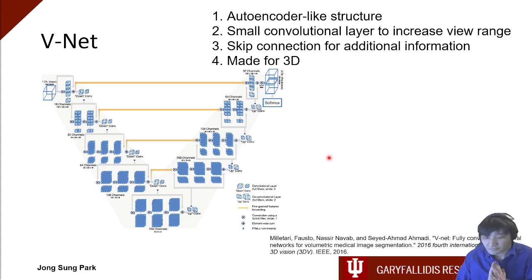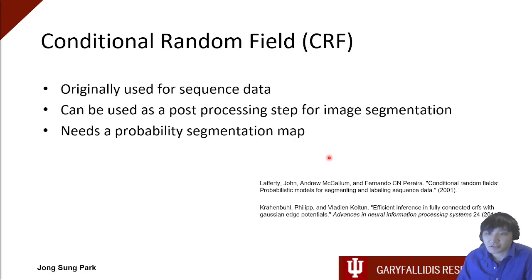However, this V-Net segmentation might not be enough, since when we're talking about brains, we might want finer, more detailed segmentation, and also we would want fewer errors for future analysis. So there is a method that could fix the small segmentation errors that could happen, which is called the conditional random field method.